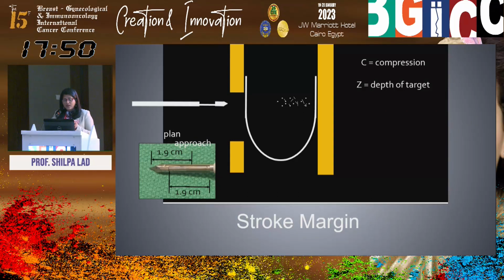With vacuum-assisted biopsy, the breast is compressed between two paddles, like we are seeing in this case. Say after compression, the thickness of the breast is 59 millimeters. This is where our microcalcifications are located. Based on the location of the microcalcifications, the depth of the target from the entry point of our needle is, for example, 51 millimeters.